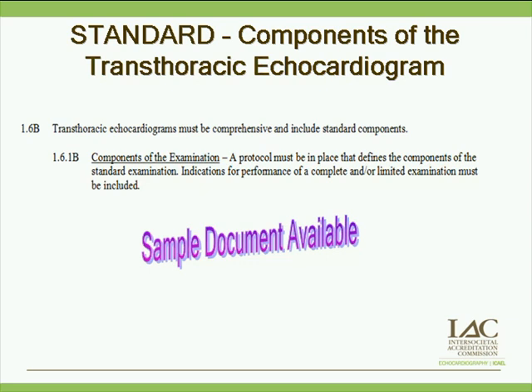I'll share a funny story with you. We had an adult application submitted a while back, and the protocol they submitted, and remember, it was an adult lab, was for a pediatric transthoracic echo. So again, make sure it's your laboratory-specific protocol.